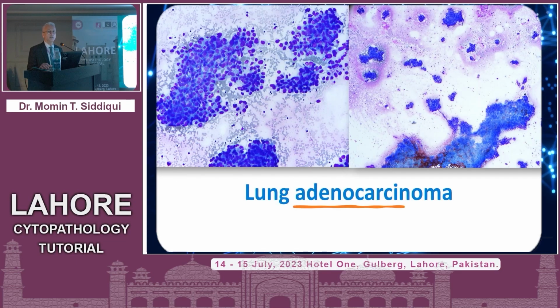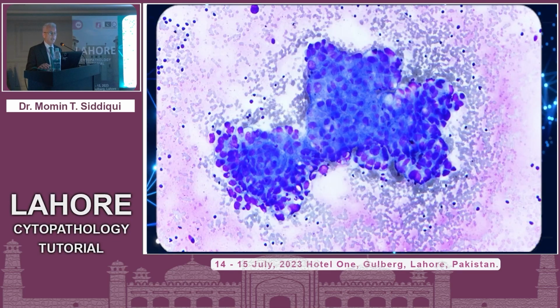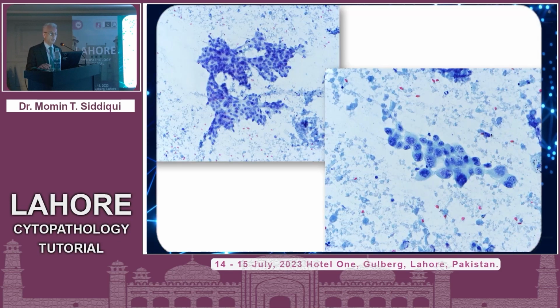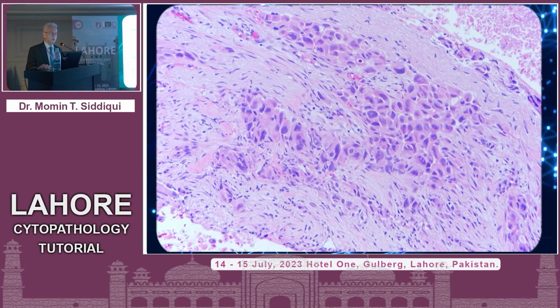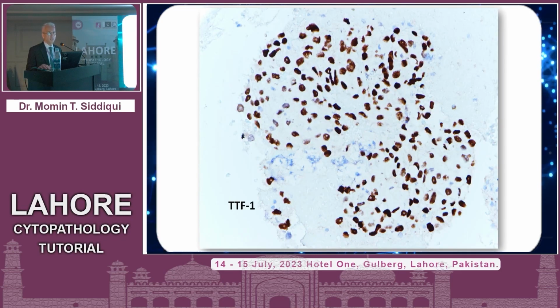An example of an adenocarcinoma over here, you can see that it's a very cellular sample, so quantitation is not an issue. Three-dimensionality, pleomorphism, anisonucleosis, gland formation, cytoplasmic vacuolation on these Diff-Quik stained images, fairly easy call. These are the Pap smeared examples. This is the cell block, and then again another cell block giving you some degeneration, which gives you an impression that these may be keratinized. But certainly if you do IHC, a single stain TTF1 comes back uniformly positive for these cells.